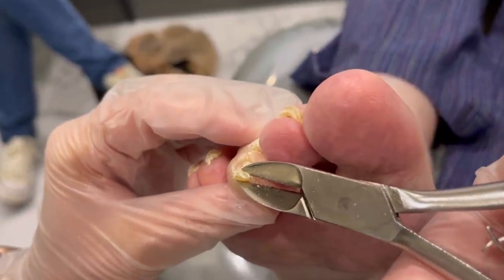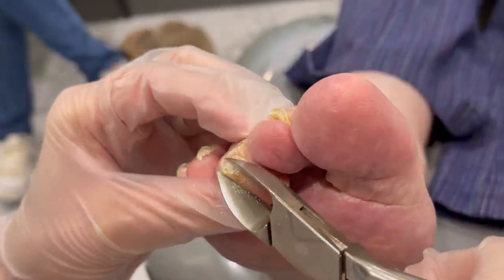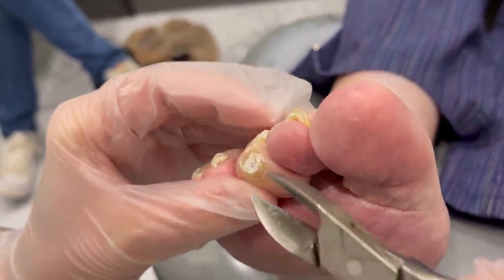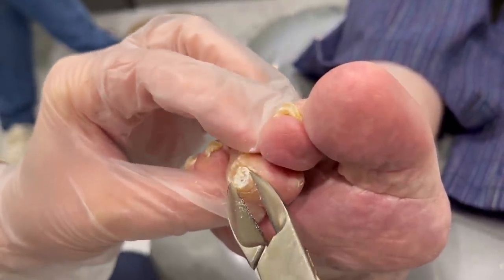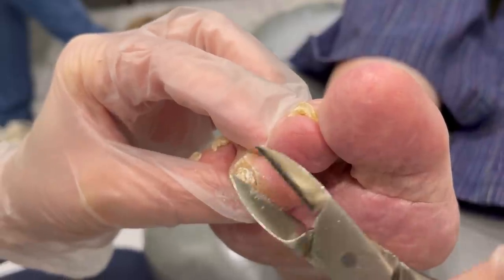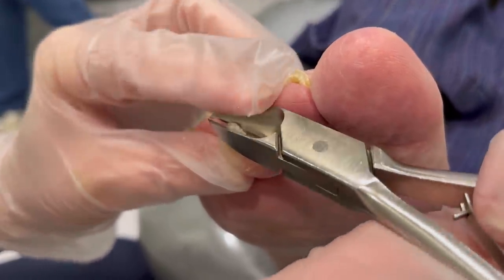The buildup in the toe position because it just hits the ground — and our feet are sensitive. I think we're almost there to be able to get the blade, but see here how it's kind of coming out of the toe. I know, I know, you're doing so good.